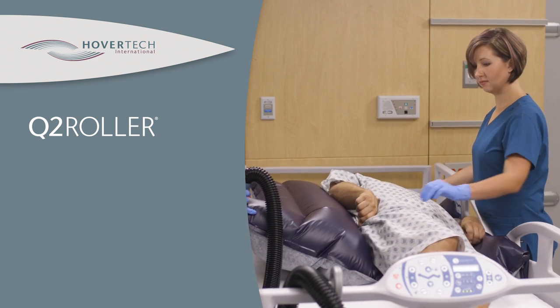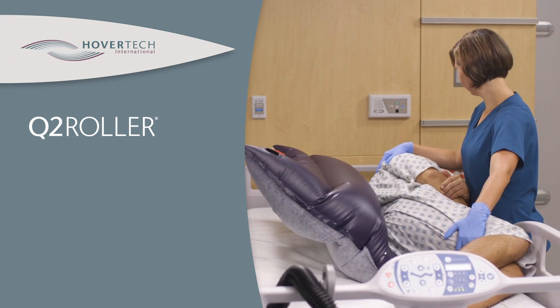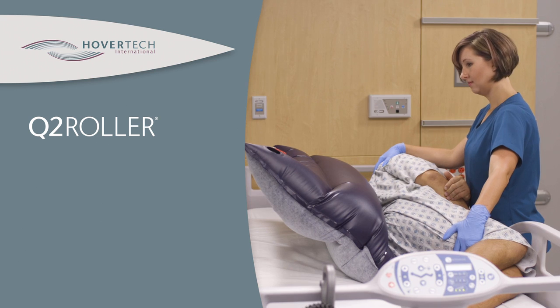It also helps reduce friction and shearing associated with repositioning and helps protect the caregiver from injury, as it gently rolls the patient without the need for manual lifting.